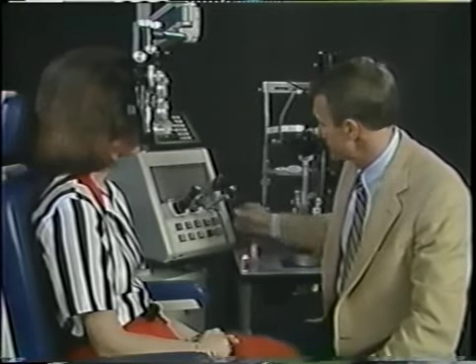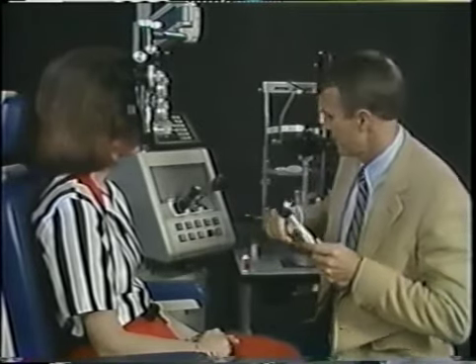If dilating drops are used, the patient can be instructed to look directly at the retinoscope light, with the other eye occluded. Now we'll neutralize each eye in turn. For the right eye, I see against movement initially, so I dial up to get with movement in all meridians. There, the against movement is gone.